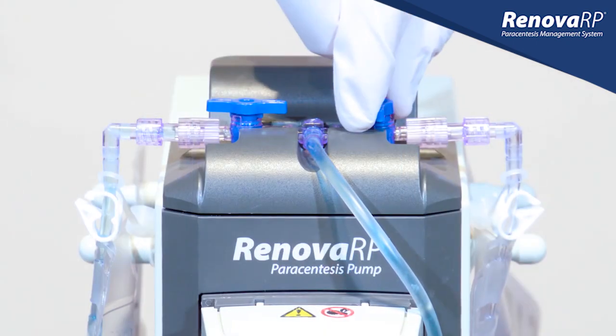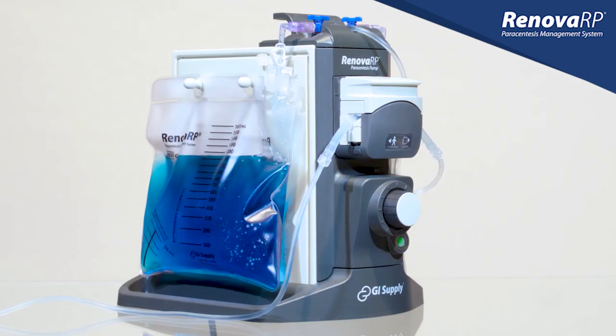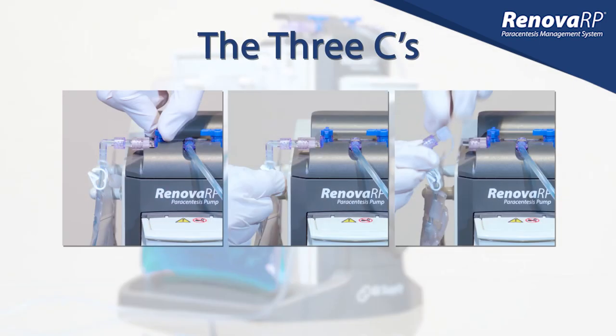As the first bag nears capacity, we open the stopcock to the other bag. Now both bags will be filling slowly. When the first bag becomes full, remember the three C's: Close. Clamp. Cap.